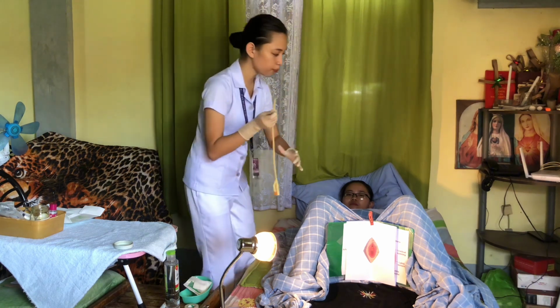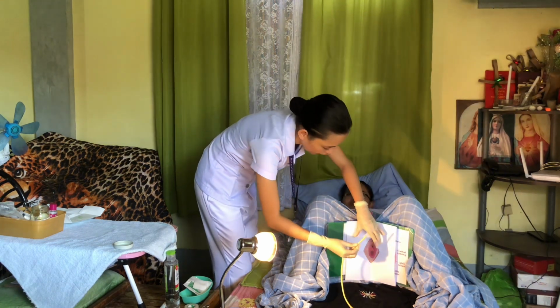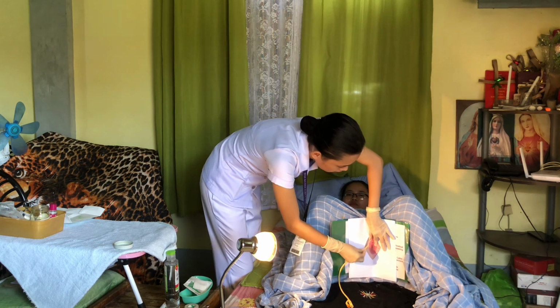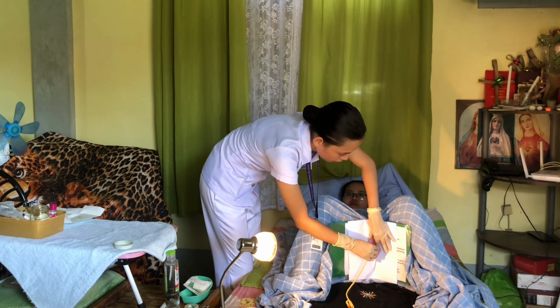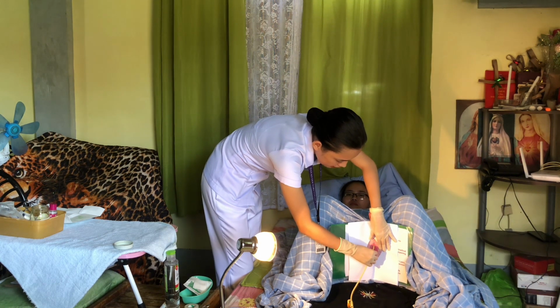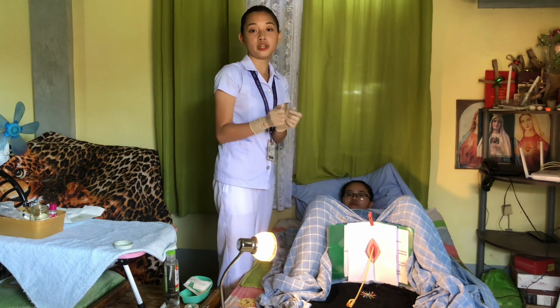So pick up the catheter at least 3 inches from the tip, and place the thumb and one finger of the left or right hand between the labia minora and separate and pull up gently. So separating the area surrounding the meatus provides visibility. So now I am inserting the catheter into the meatus for around 2 to 3 inches until urine begins to flow. So it is known that the female urethra is approximately 1.5 to 2.5 inches.